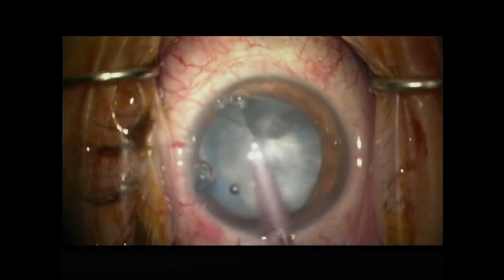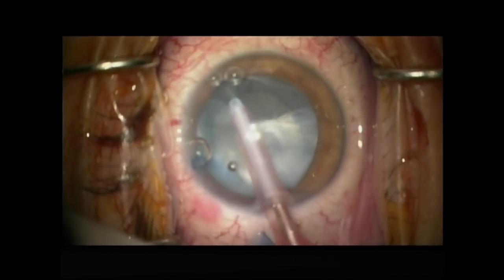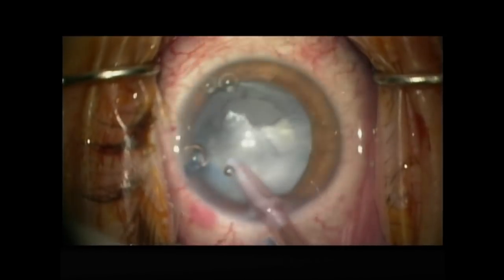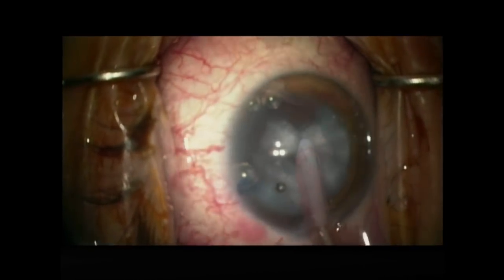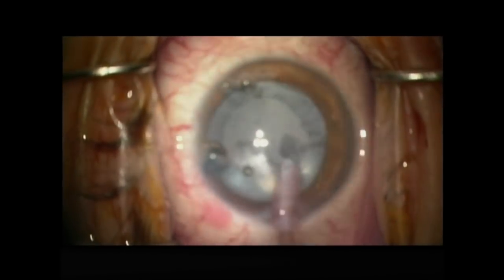Trypan blue was used to stain the capsule and a continuous capsulorhexis was made. At this point, the cataract was noted to be composed mainly of soft cortical material, and this was able to be removed with the I/A. As the cataract was removed, a large tear in the posterior capsule was found.